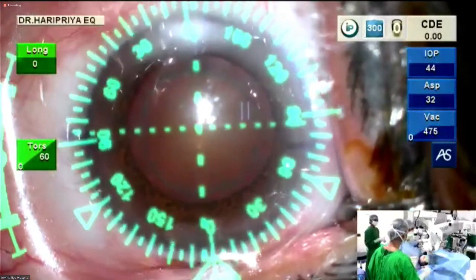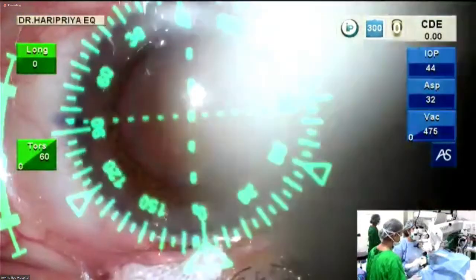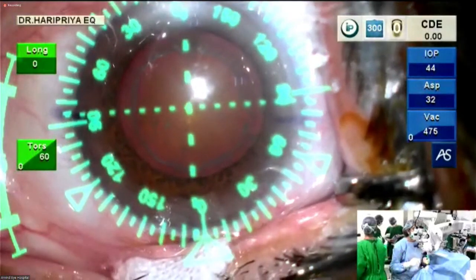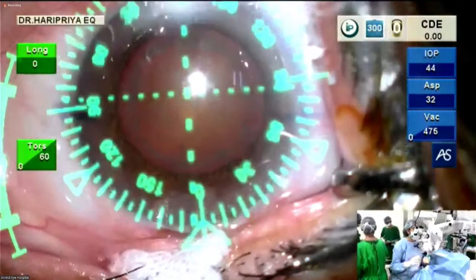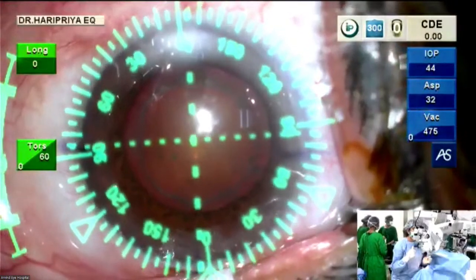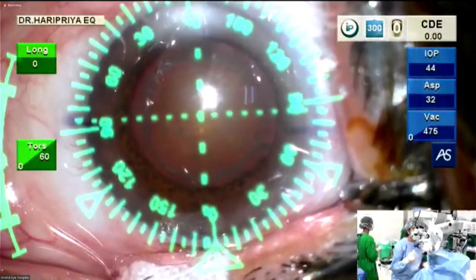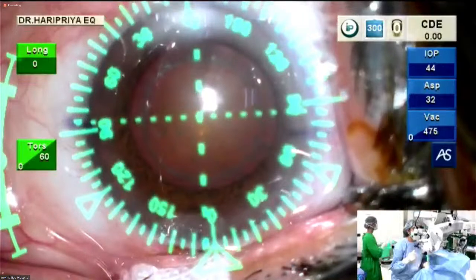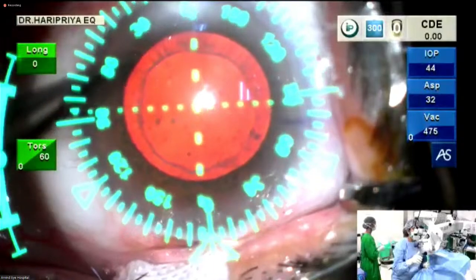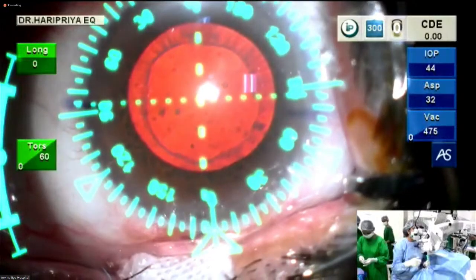As was earlier mentioned, this is a patient post-pterygium, so you can see the pterygium scar here. It's about 2.25 cylinder, where K reads two diopter cylinder. We normally wait about 6 to 8 weeks after the pterygium surgery for the astigmatism to stabilize before we plan the cataract surgery. If there is a residual cylinder, then we go ahead and do a toric implantation. This patient, as you can see, also has some pseudoexfoliation material on the anterior lens surface, and it's a grade 2 to grade 3 cataract.